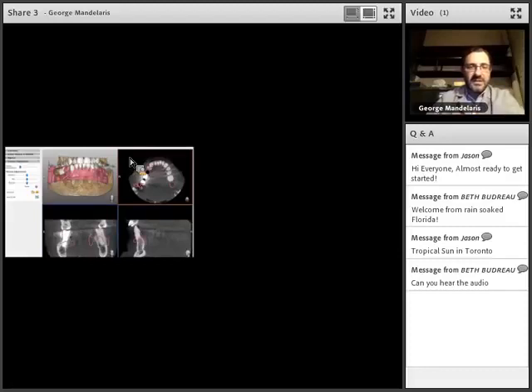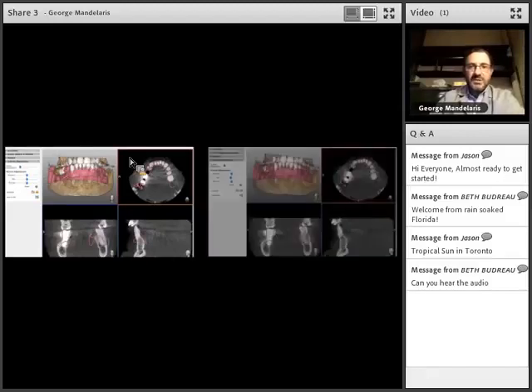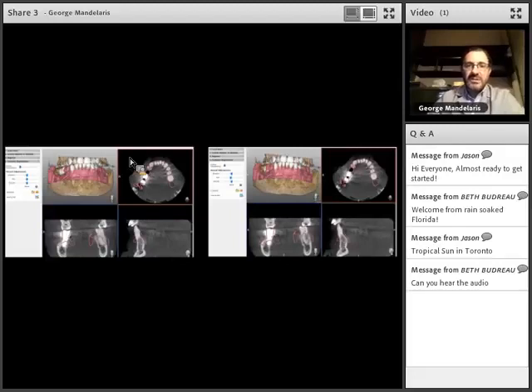You'll notice that they're all pretty much in the same vertical column, and they're not exactly accurate. If you look at the lower central incisor, you'll notice that the STL file is a little bit lingual compared to the position of the tooth. So I'm going to change the yaw, pitch, and roll, and you can see the manual adjustments now on the right have all been modified just a little bit, making the registration of the lower central incisor and the molars a little bit more correct.